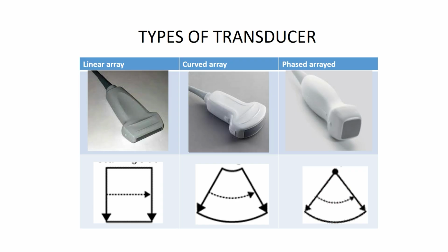Let's discuss the types of transducer. There are three transducers commonly used in routine practice.